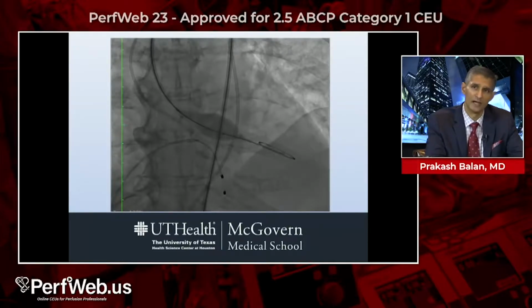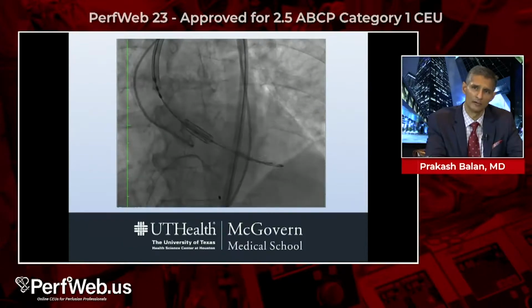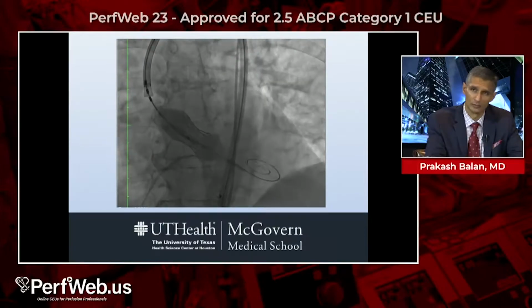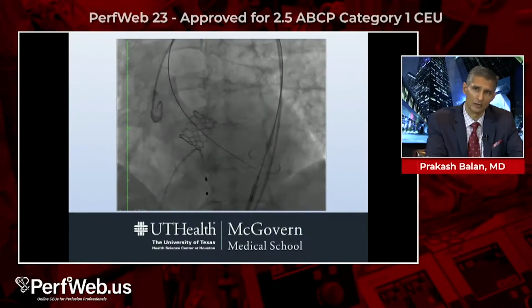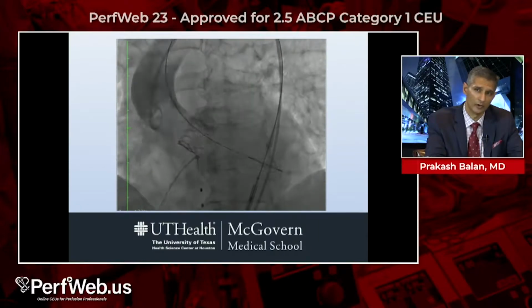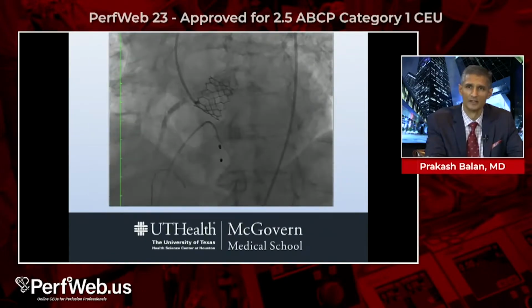We were then able to dilate with a larger valvuloplasty balloon, and then ultimately bring our valve across and smoothly deploy the balloon expandable 23 millimeter prosthesis. At this point, we again had VF, and when we take our aortogram, something's missing. That right coronary artery doesn't appear to be there at this point. The EKG is showing us ST elevations, and now we're getting hypotension as well, 80s over 40s. She's looking truly shocky to us.